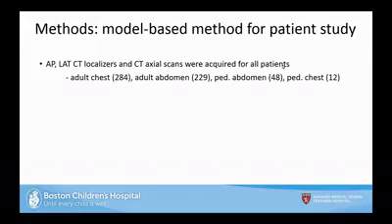So are you saying if you put like, so you determine the magnification factor of the patient's size, right? That is a function of the table. Yeah, so we have it on the table. Yeah, but it's actually a function of the patient. It's actually more that, not the table height. Right, something in between the patient and the table.